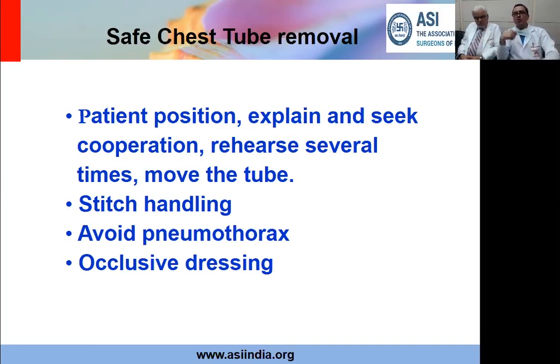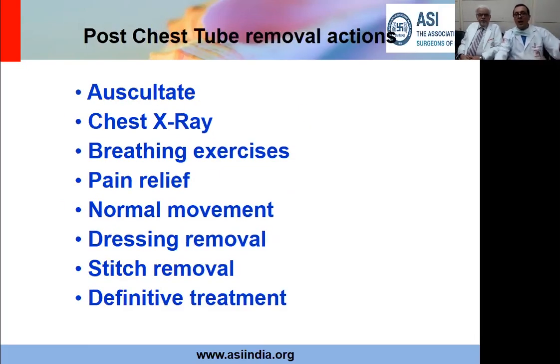So you pull out the tube and side by side, you tighten the purse string so that the air does not go inside. But important thing again is to explain to the patient. And if you can manage to give some local to the patient, trust me, you will have a lot of cooperation from the patient. Again, before you remove the chest tube, you auscultate. After you have removed the chest tube, you again auscultate that there is no decrease in the air entry.